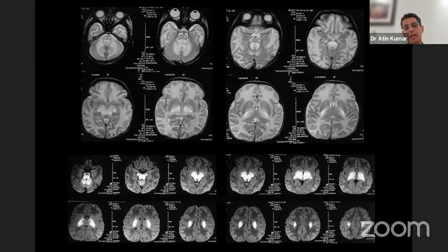What I would suggest is go back tomorrow itself, look at some normal images of a neonate T1, T2, look at normal pathologies, maybe Google, maybe in your textbooks, and you'll absorb it better what I've shown you today.